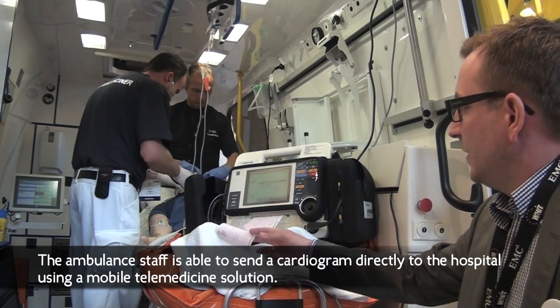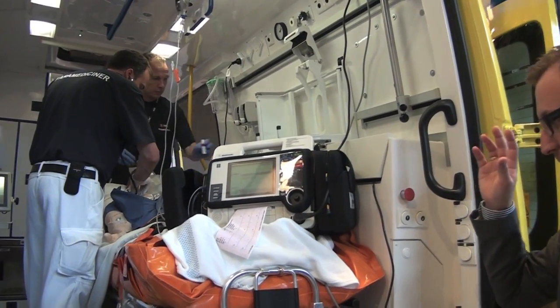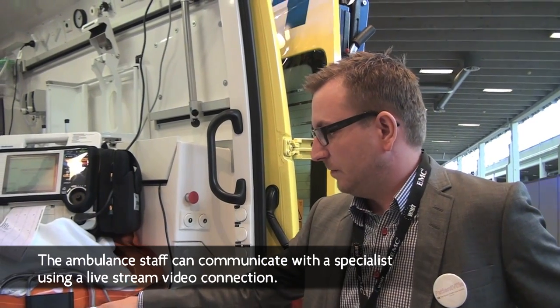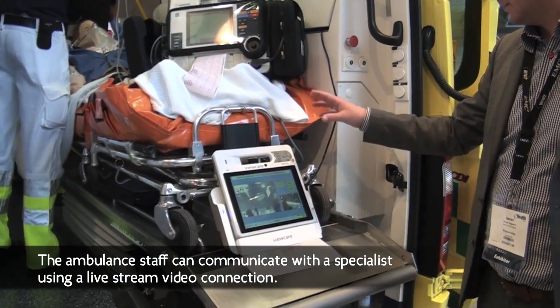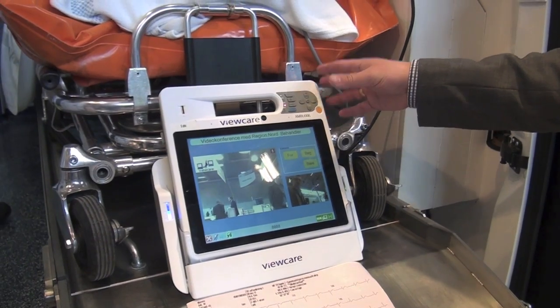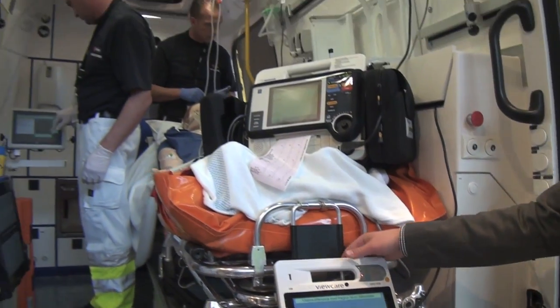On the basis of this, the attending cardiologist at the hospital has the possibility to engage in a video conference using this device, which is a portable video conference solution, and use this for a video conference call with the paramedics.